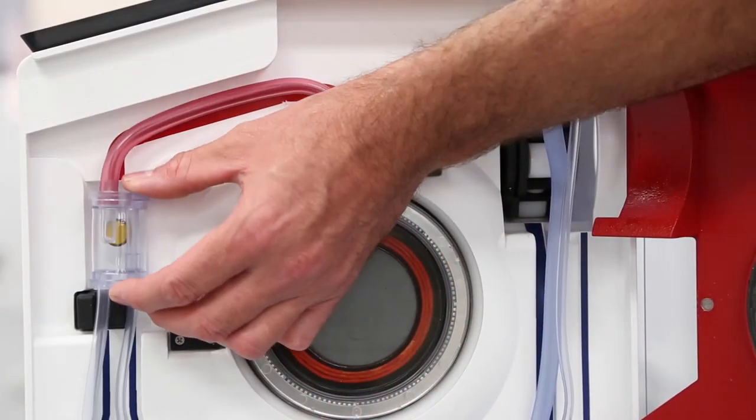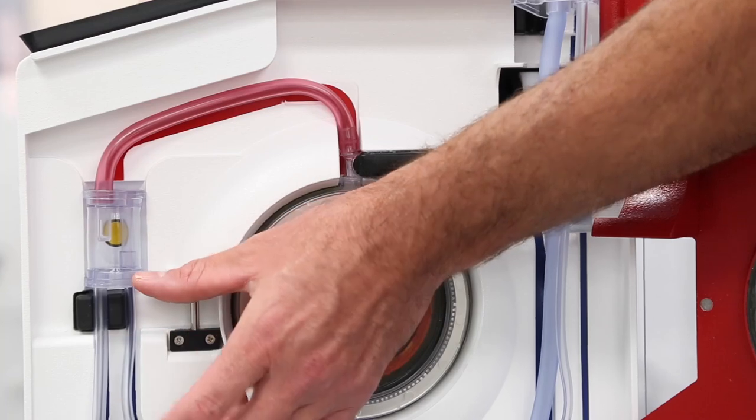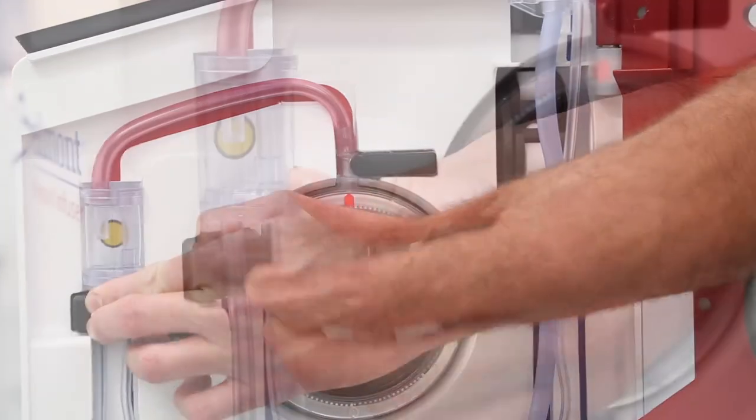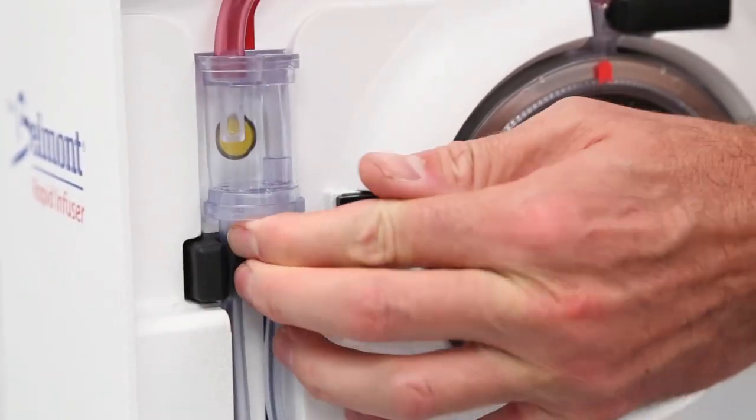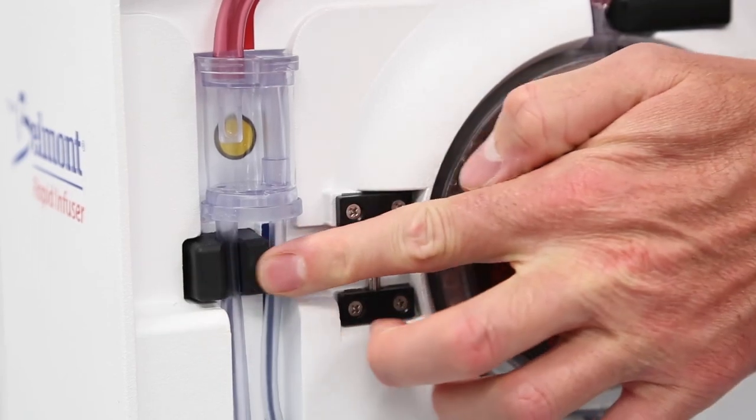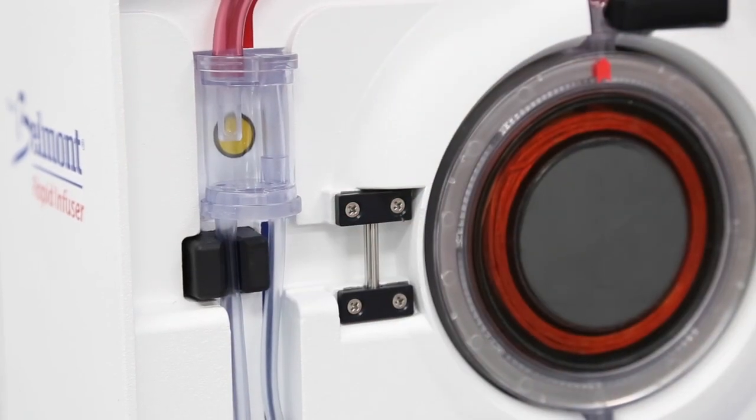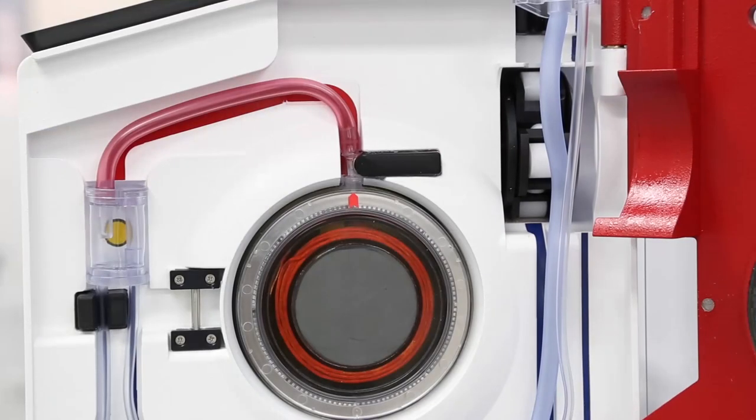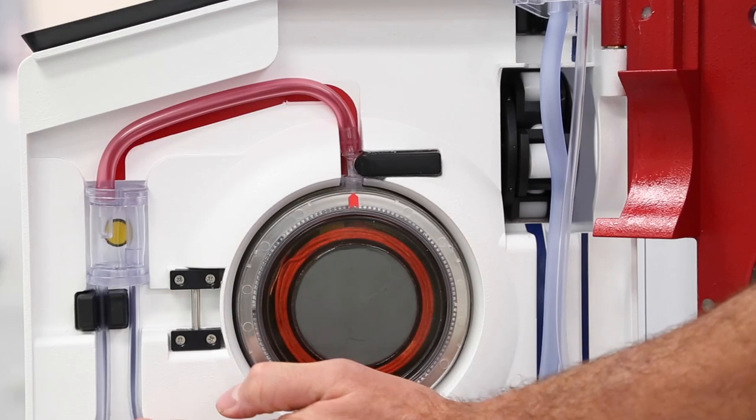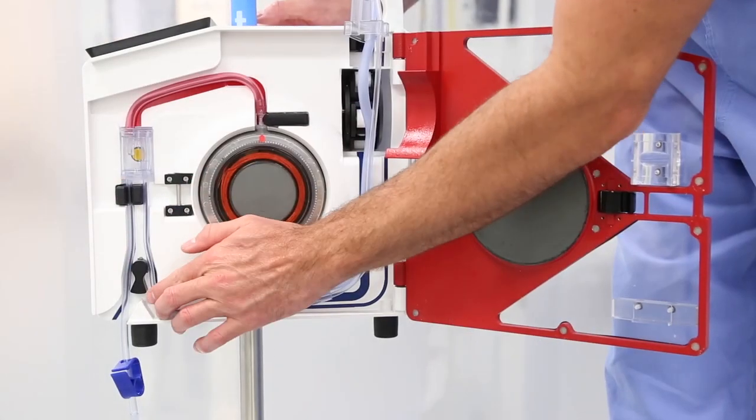Align the red tubing on top of the red stripe and place the pressure chamber into the pressure channel. Press the infuse line into the secondary air detector to the left of the patient safety valve wand. Note, the infuse line should be at or below flush within the air detector. Place the thinner recirculation line to the right of the air detector and to the right of the valve wand.